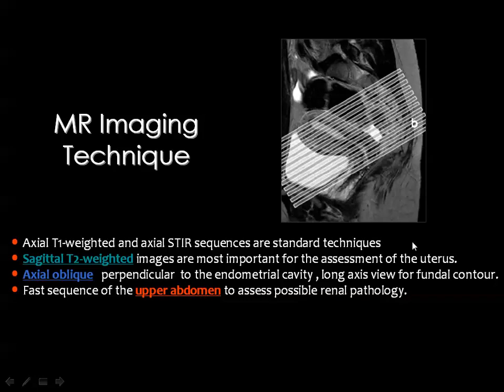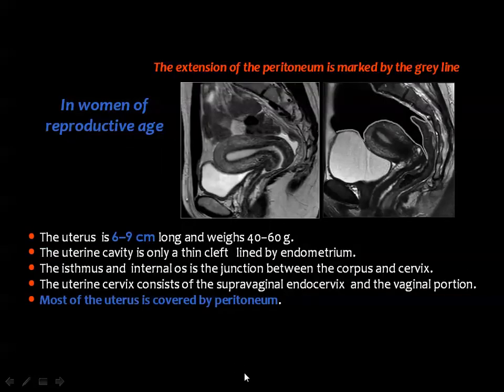the cervical canal. And it's a good policy to have some scans for the abdomen, searching for, let us say, metastatic deposits, lymphadenopathy. And whenever you are dealing with the uterine congenital anomalies, one of the helpful ideas is to look for renal anomalies as well.